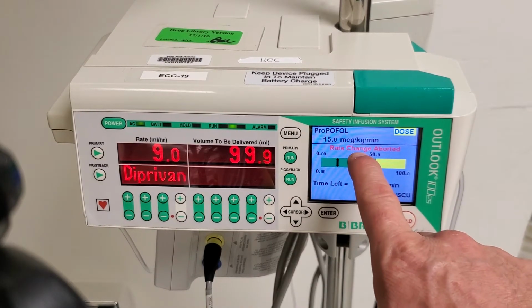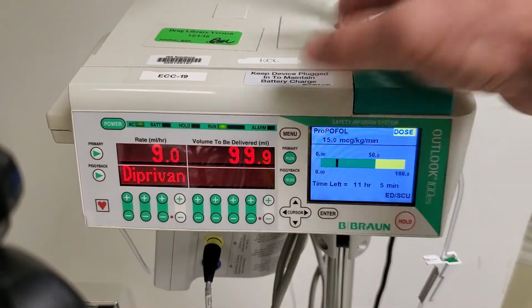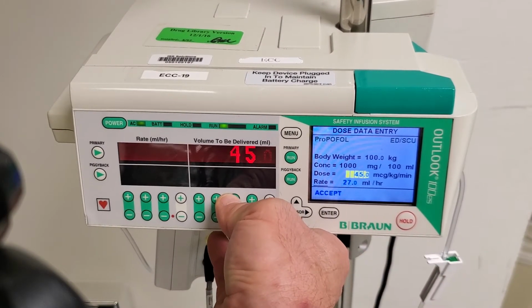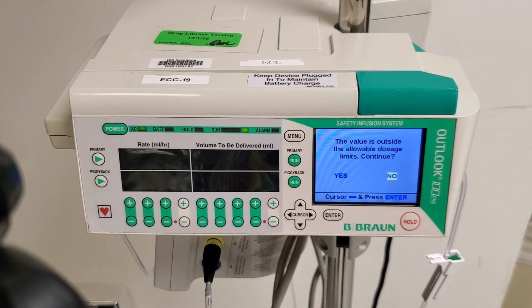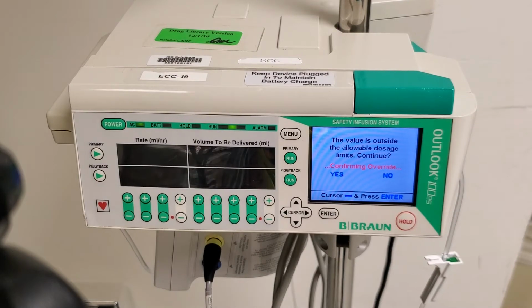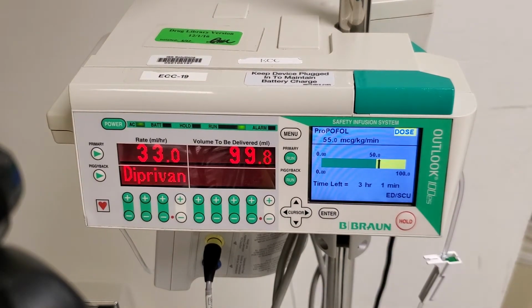Remember, if you don't confirm your changes, it aborts the change and reverts back when the alarm sounds. So let's do that again quickly. Outside the limits, yes. Confirming override, and now we're pumping. And notice our arrow has moved into the yellow.